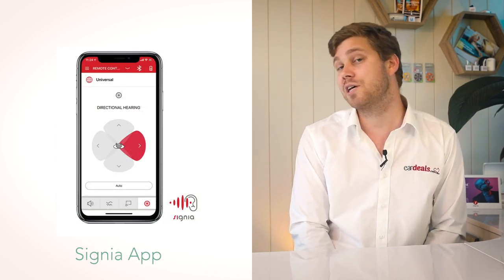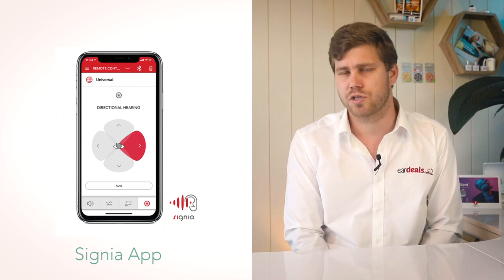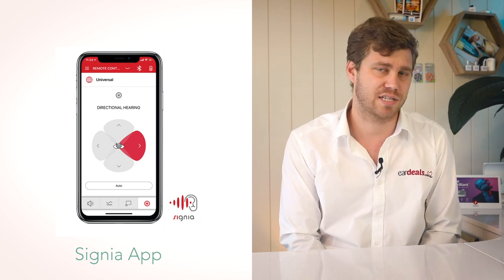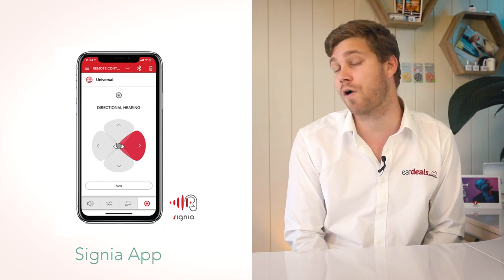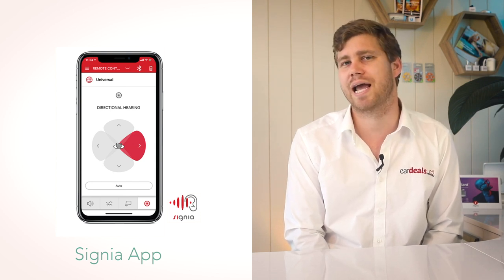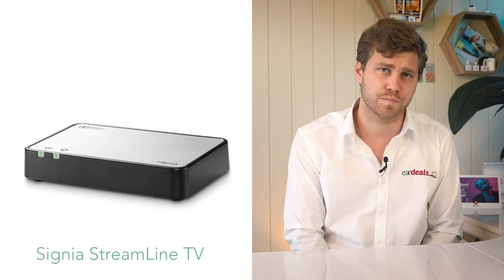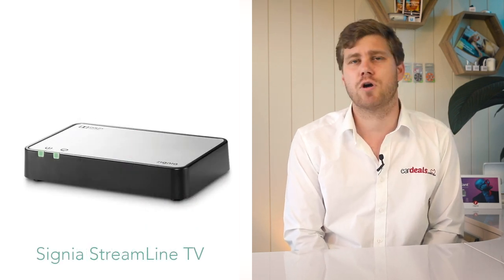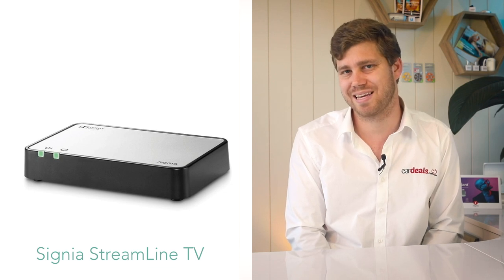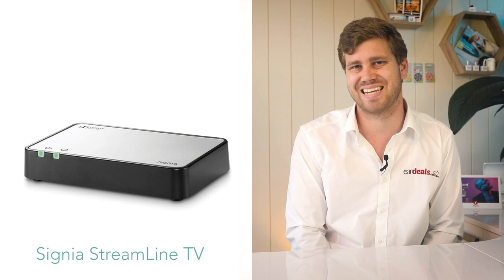There's also an accessory that gives you the ability to connect to your phone — so if you have the latest hearing aid technology but an older phone, it enables Bluetooth calls. Finally, the most popular accessory is the TV connector, which in Signia's case is called the Streamline TV.